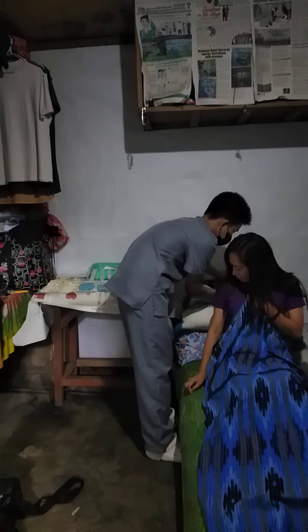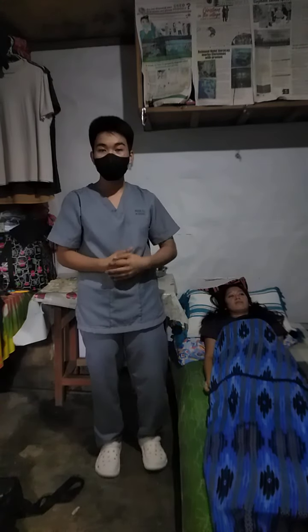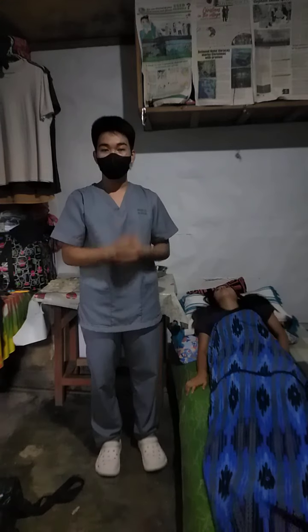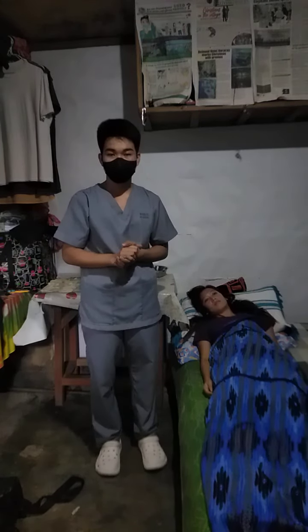So, ma'am, position lang po tayo. The upright position is more natural for swallowing and protects against bronchial intubation and aspiration if the patient should vomit.